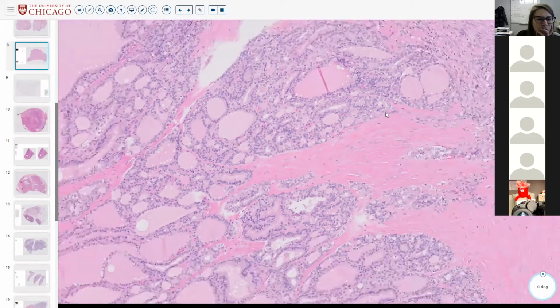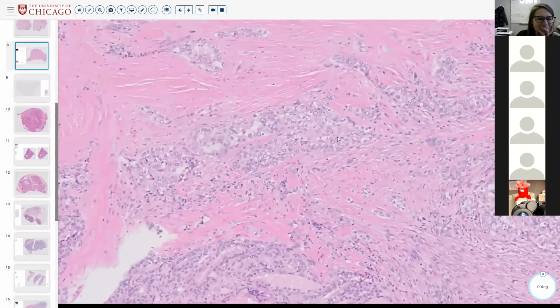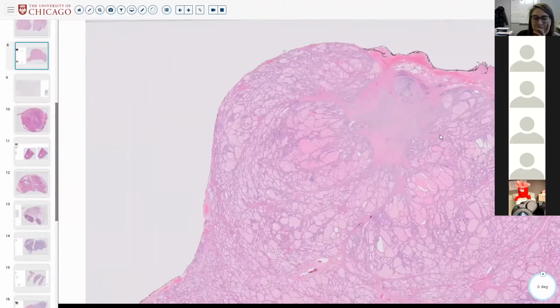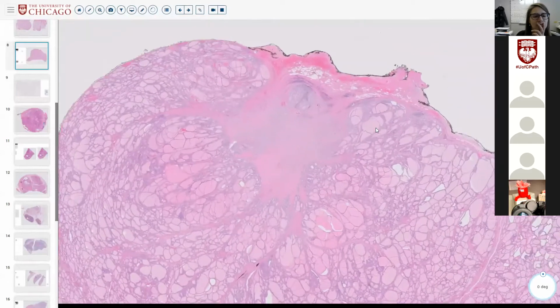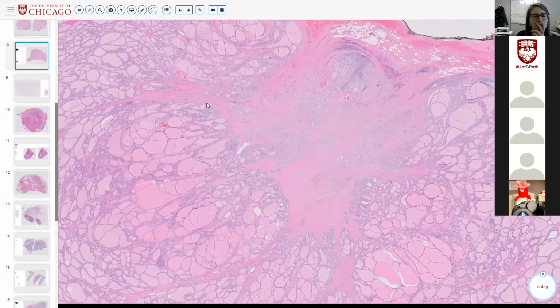Just sort of tuning back in here right now, but I'm seeing these long tendrils of very dense fibrosis. Does that concern you on low power? In other contexts, certainly it would, in terms of having an invasive lesion, but no, I don't actually see anything here that I would clearly call neoplastic.